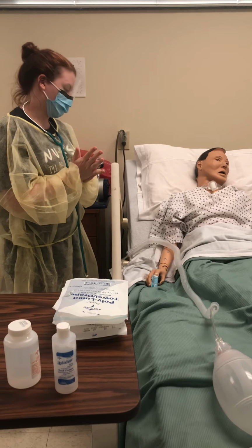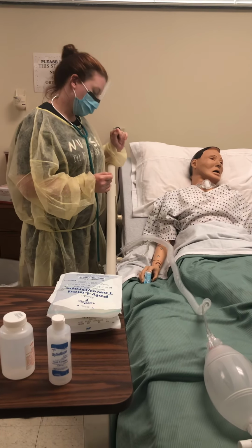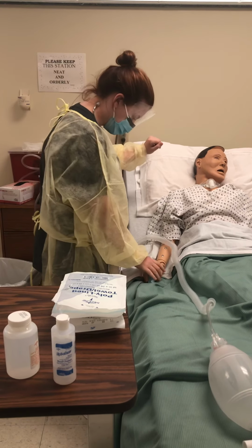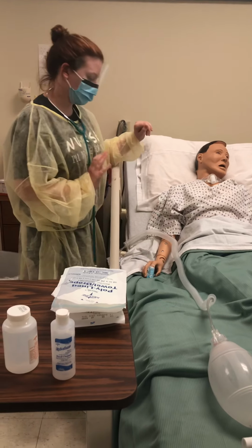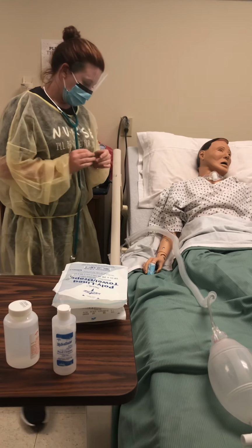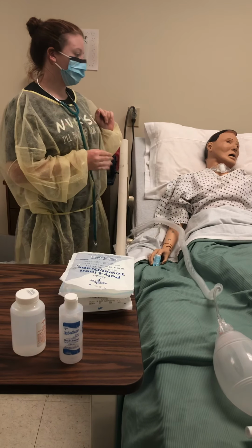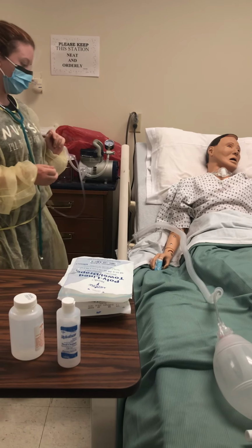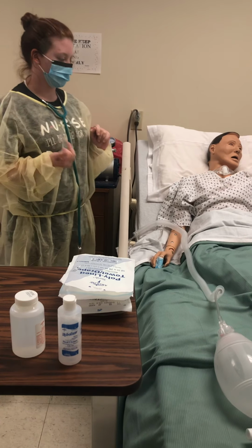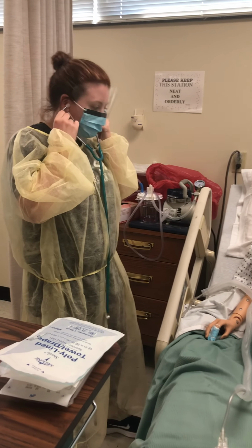I'm going to ask him to state his name and date of birth for me, and it matches his armband, so I know I've got the right patient. And I see that he is already in mid-Fowler position. And next, I'm going to assess his lung sounds to see if he needs suctioning. So I'm going to go ahead and listen to his lungs.